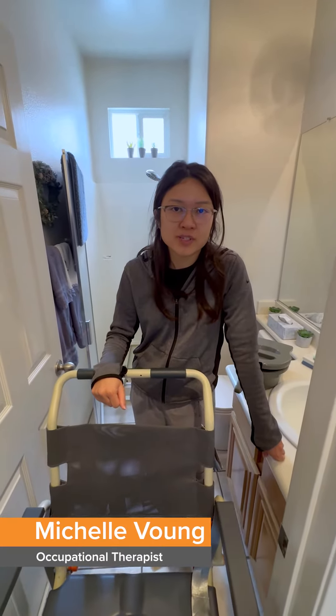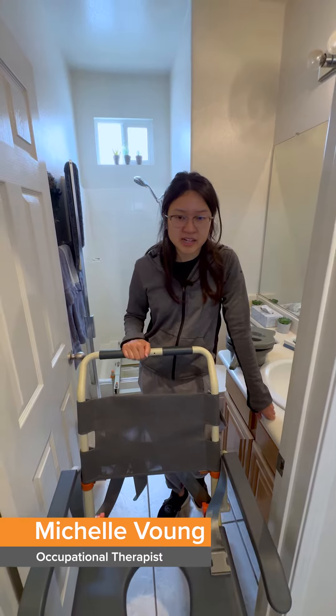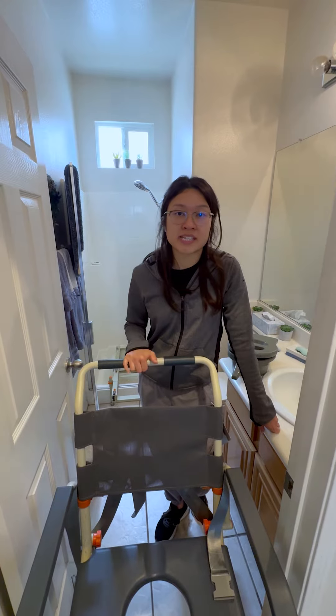Hi everyone, my name is Michelle Vong. I'm an occupational therapist with Rehab Without Walls. I'm here with Israel today and we have a client that's coming home from rehab acute care and needs to figure out her shower seating system.